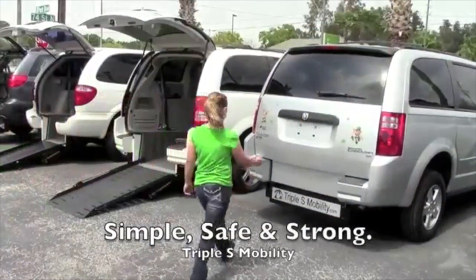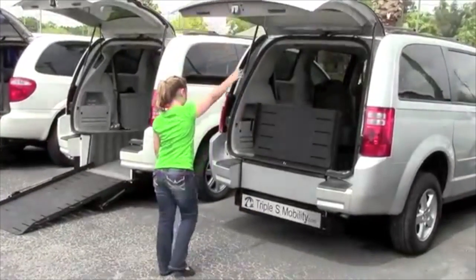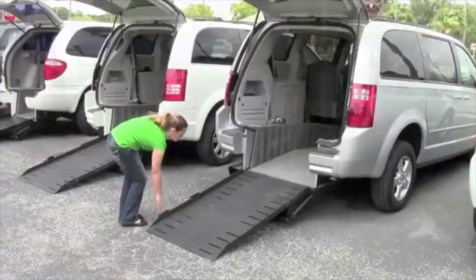At Triple S Mobility, our wheelchair vans are manufactured simple, safe, and strong. They're easy enough to open and use that a nine-year-old girl can simply put the ramp down and prepare the van to be used.